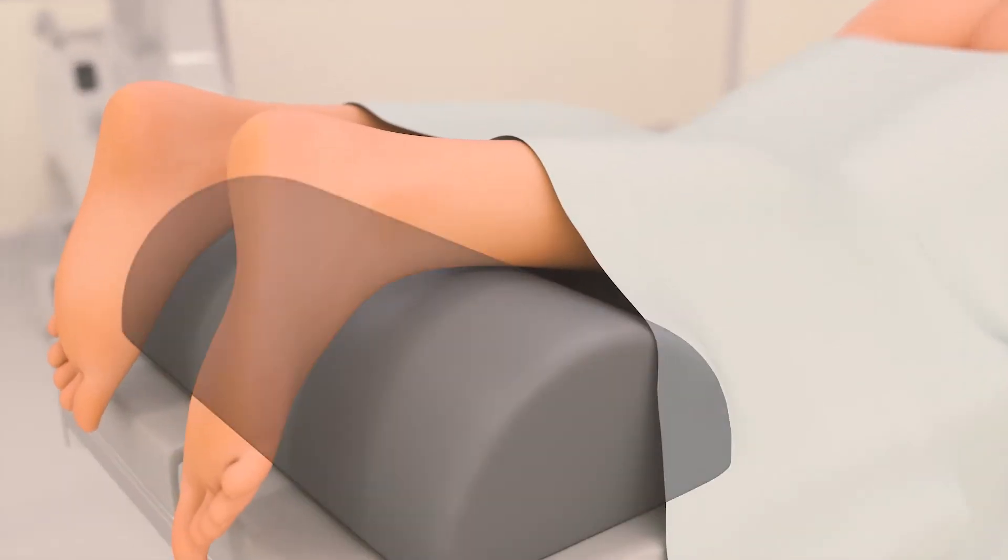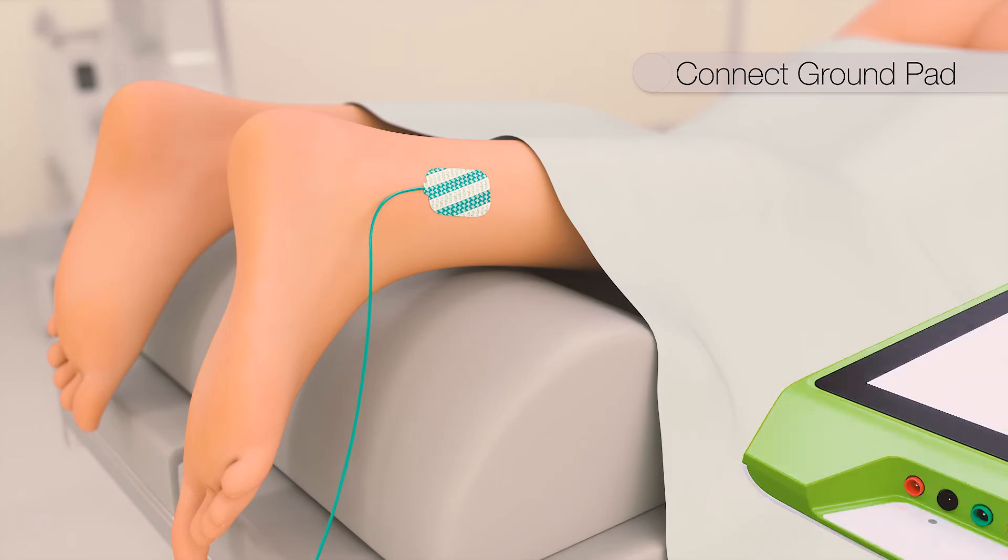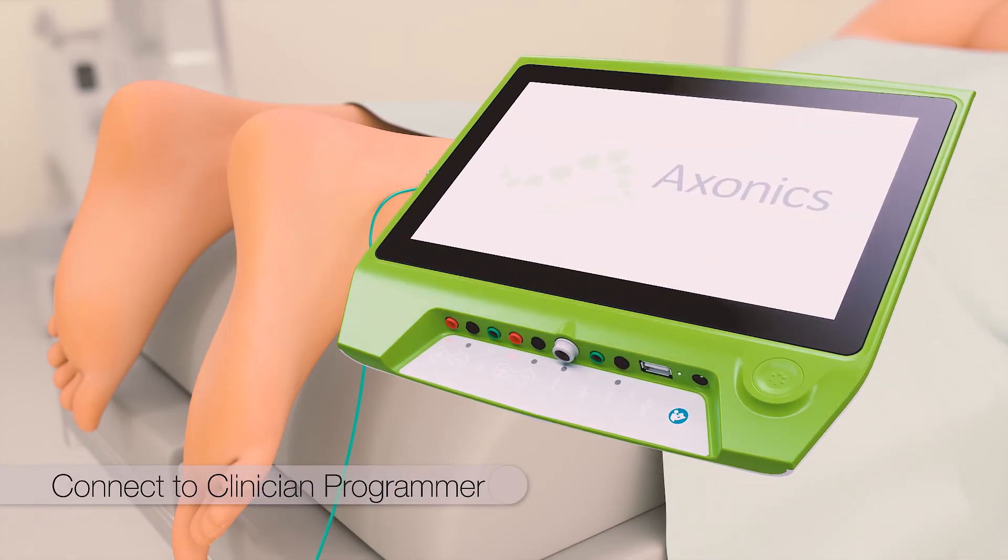Support is placed underneath the feet to allow the toes to be free to demonstrate motor response. The ground pad is placed on the patient's leg. The cable is then connected to the axonics clinician programmer.